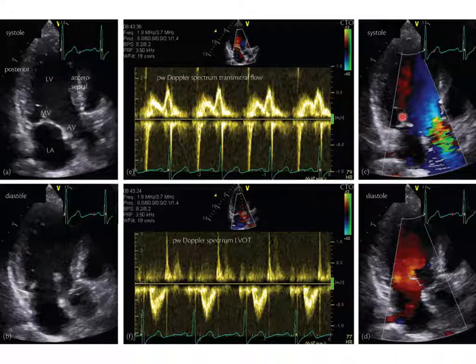And in this case, you can see all of the velocity is going up through the aorta. So we're measuring velocity as a function of direction away from the transducer. So you see there's a peak velocity here. This is all going away from the transducer. This is coming towards the transducer.